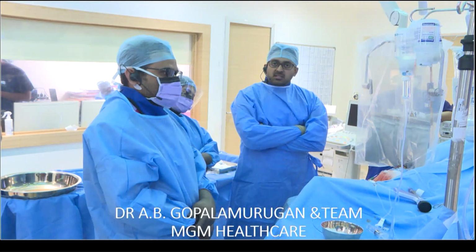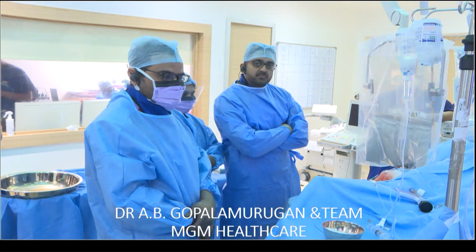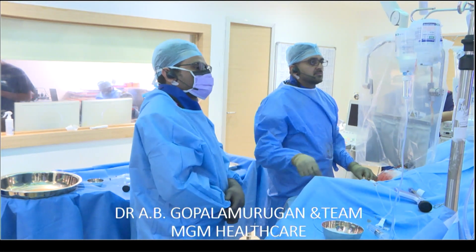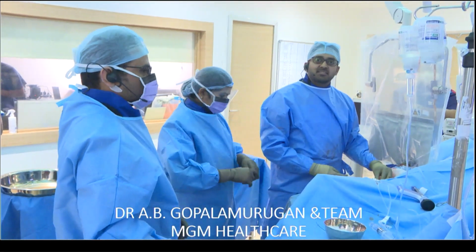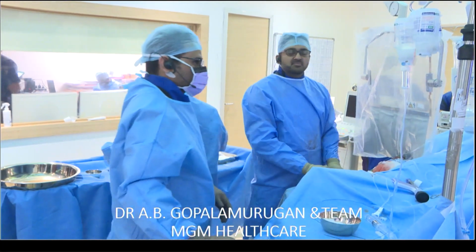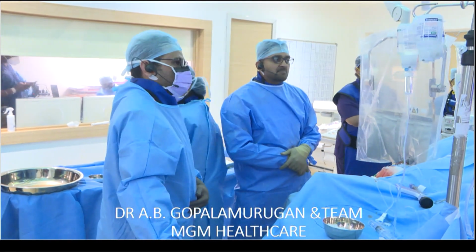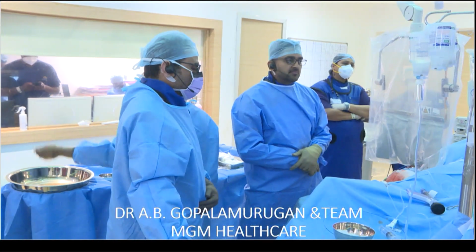So very pleasing result. Thanks for having us, and we are honored. Gopal. Excellent. Thanks. Very nice case. Anuj, yeah, and Vimal is there back. Yeah, very nice case, Gopal. Very nicely done. Thank you, sir. I'm honored. All meticulously done with excellent result, and it's impressive to see how meticulous you are. Even a few struts in the ostium of the circumflex, you didn't mind to dilate again. So sure. It's really fantastic result.